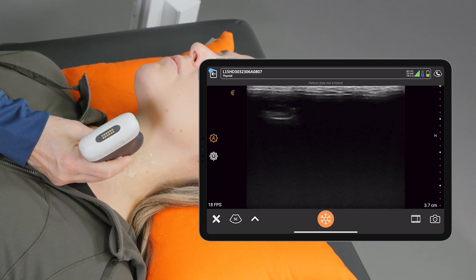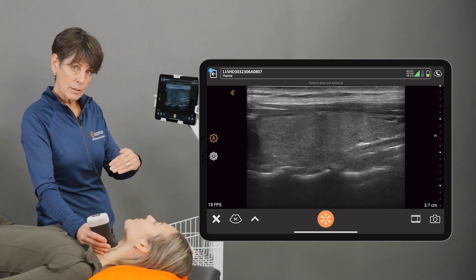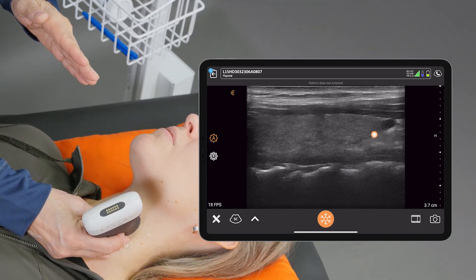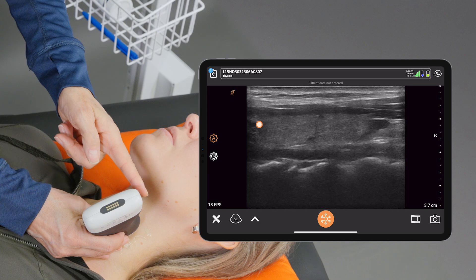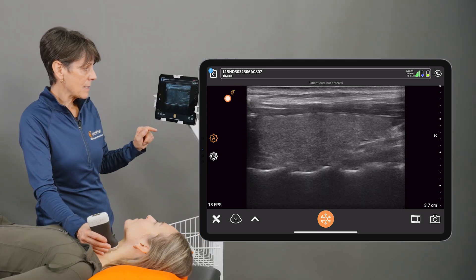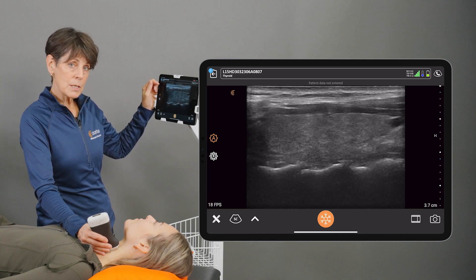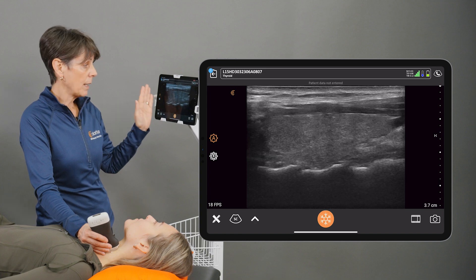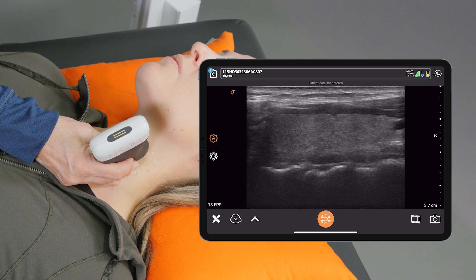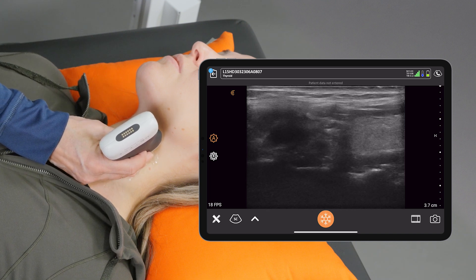If I rotate the scanner 90 degrees, now we're looking in long axis on her neck, or a sagittal plane, and I've got her thyroid gland here. The typical transducer orientation is to have the transducer indicator toward the patient's head. If that's the case, everything that is on the indicator side of the image is now toward the head. So if I slide the scanner toward the indicator, we're seeing more toward the head.